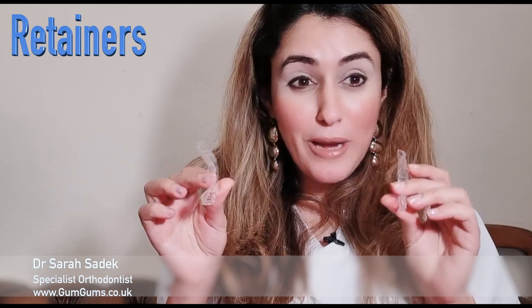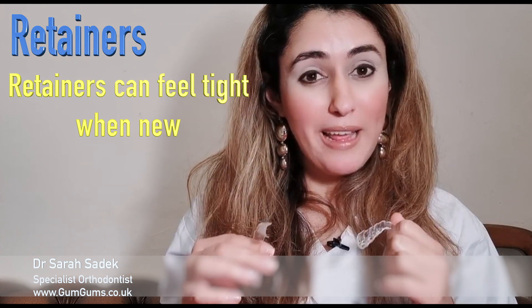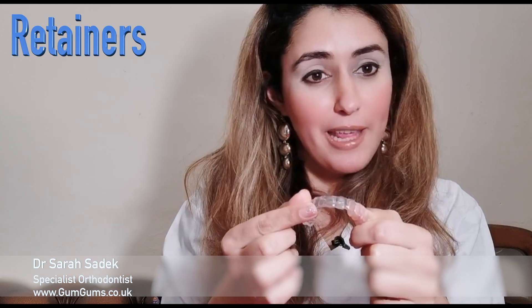I have my retainers here — I still wear them years after removing my braces. Your retainers will normally feel tight when you first wear them, a bit like a new shoe, but the more you wear them, the more comfortable they will feel. It's easy to tell which is the top and which is the bottom just by looking at the front of them and the shapes of the teeth.